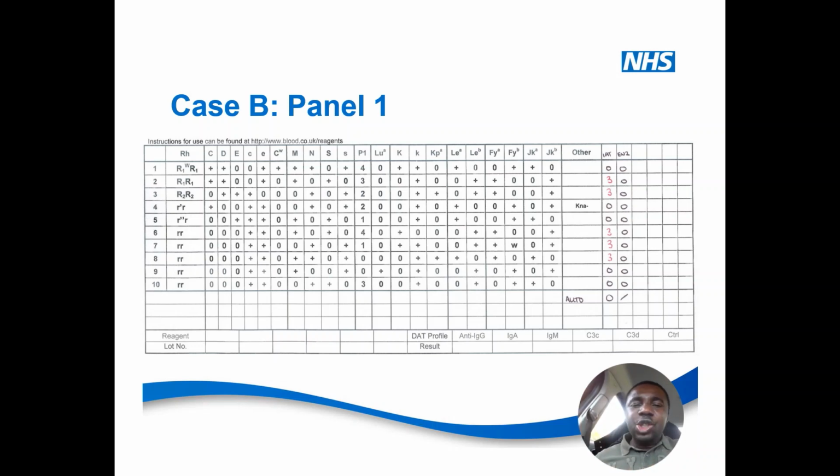Happy days. I showed you guys something during my first antibody panel, part 1. I told you guys once you see 0, 0, 0, 0 in the enzyme, start suspecting those antibodies that can be destroyed by the enzyme, which are MNS and Duffy A or Duffy B. But let's still keep a blind eye on that and go by our cancellation method. Okay? Good.